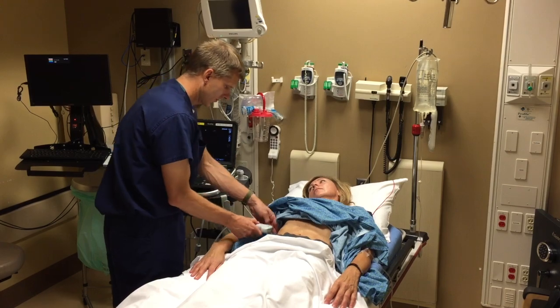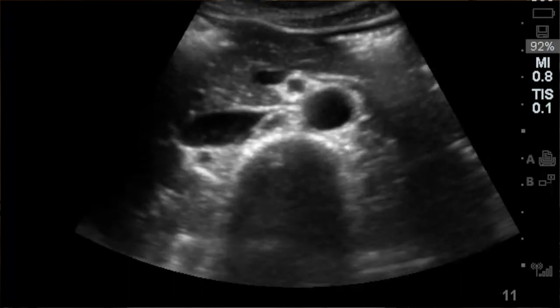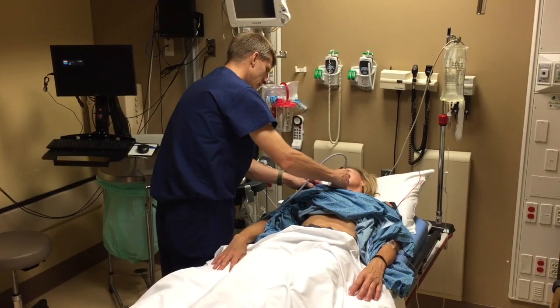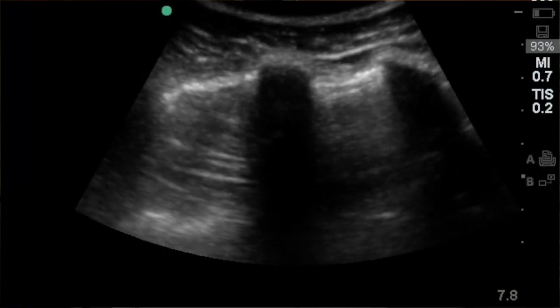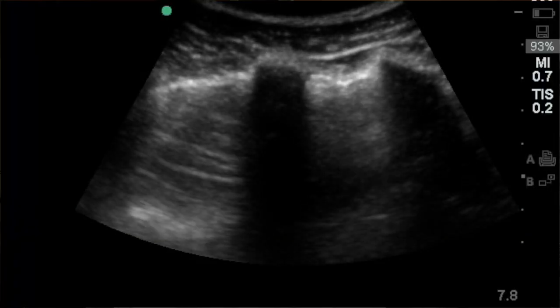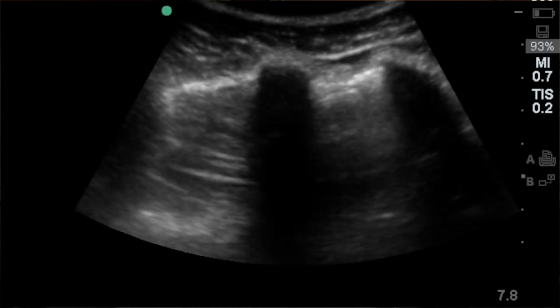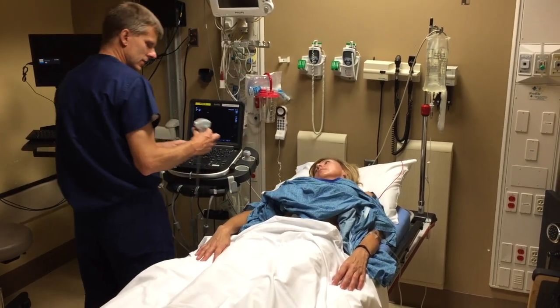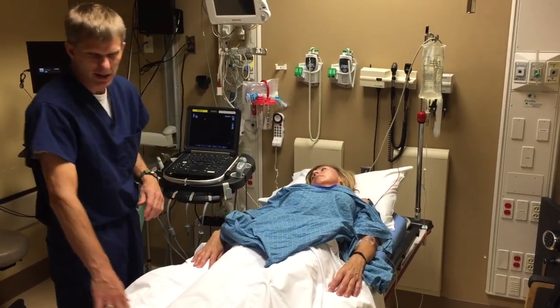No free fluid in Morrison's. Take a look at the aorta. Let's look at the lungs — great sliding on both sides. This is definitely a volume issue. Wait — she had a fever of 103. This is sepsis. Let's get some aggressive fluids going and early antibiotics.